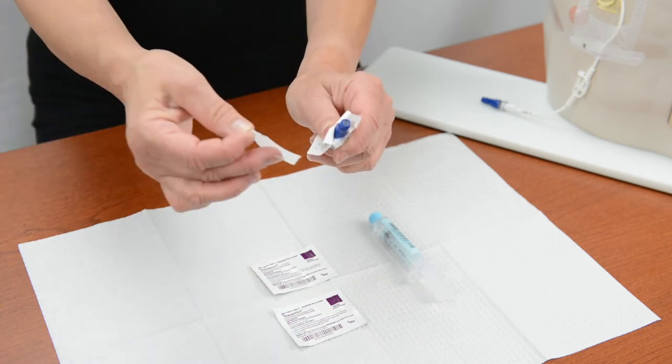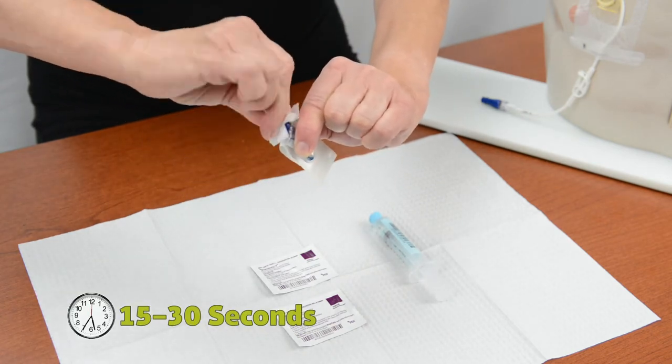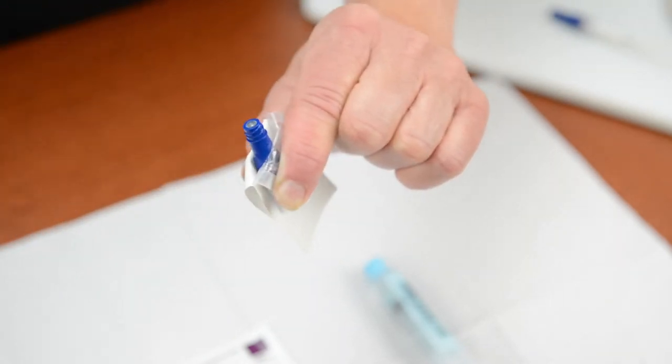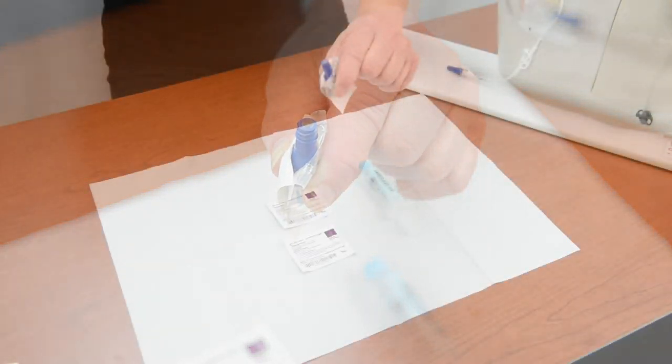Use the first disinfecting pad to scrub the hub on the connector for 15 to 30 seconds. Let the hub air dry completely. Do not fan or blow on the hub to speed up the drying.